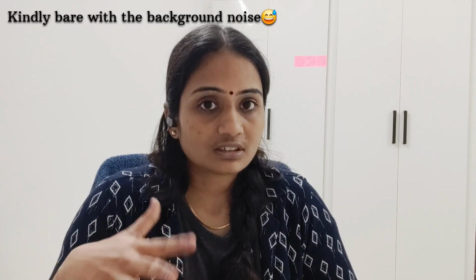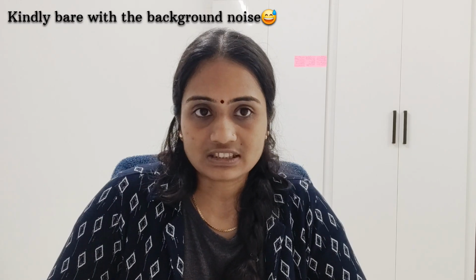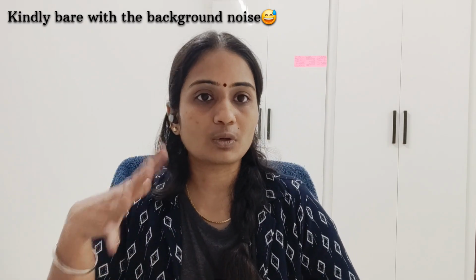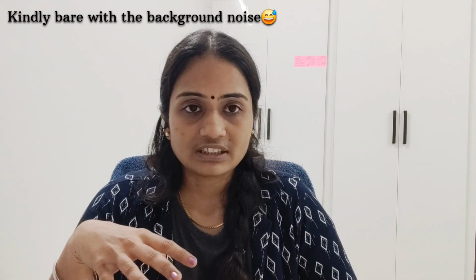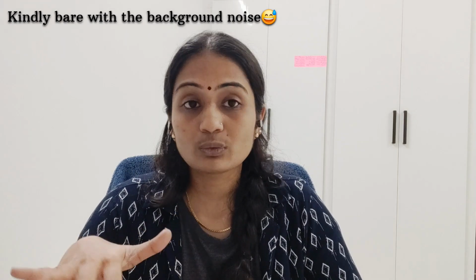They derived this technique with reference to Pascal's law. Like during school days, our science teacher used to demonstrate with a water bottle: when we put holes, the water leaks through the holes with equal pressure. Like that, they say take a large tray and put the impression material. Here the confined liquid is the oral tissue and the impression material.